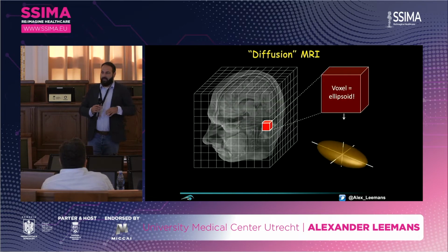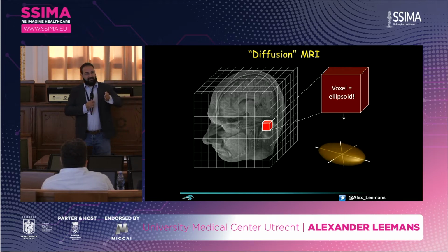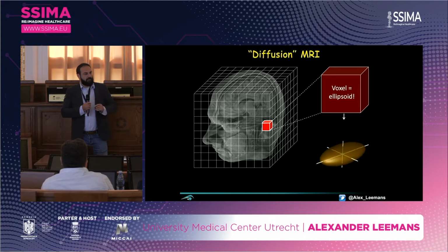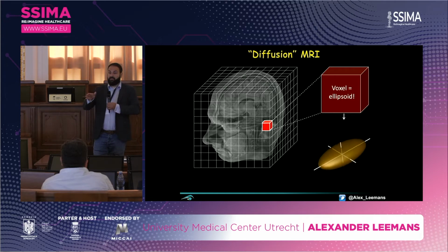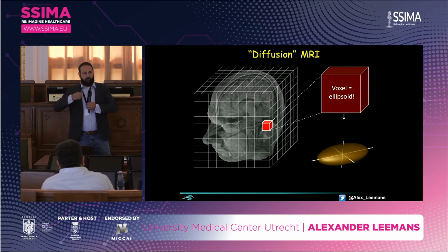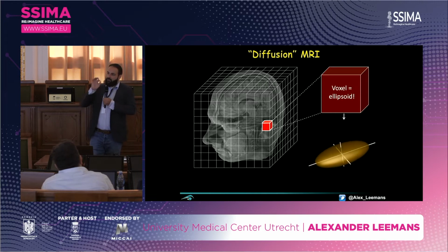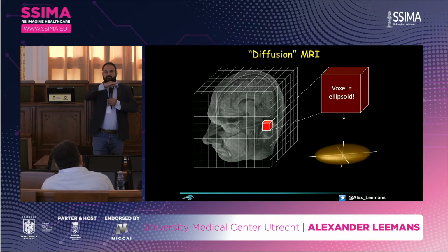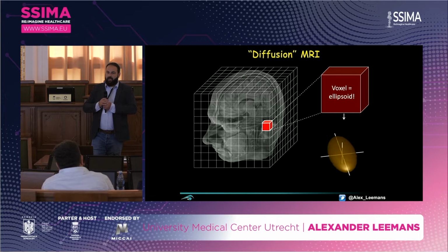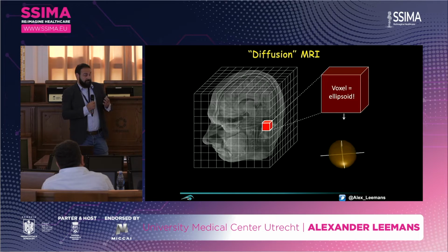Okay, so every voxel of our data set is now a series of scalars. Like, for instance, with functional MRI, if you're familiar with the BOLD signal, you acquire many, many images, and those reflect, let's say, your activity in the brain, from which you can then compute which brain regions were active for which task, etc. Well, with diffusion MRI, you got this array of values, and they represent the amount of diffusion along a specific orientation. And the idea now is to try to quantify this. And this was proven to be very difficult.